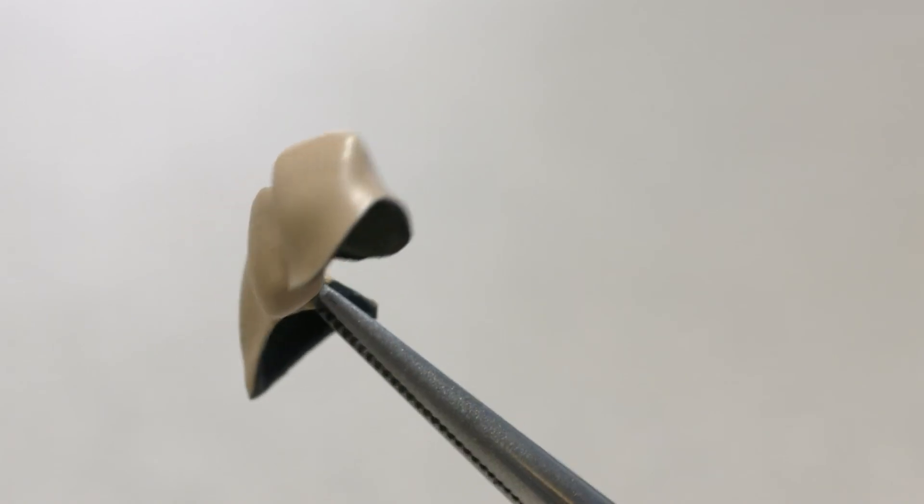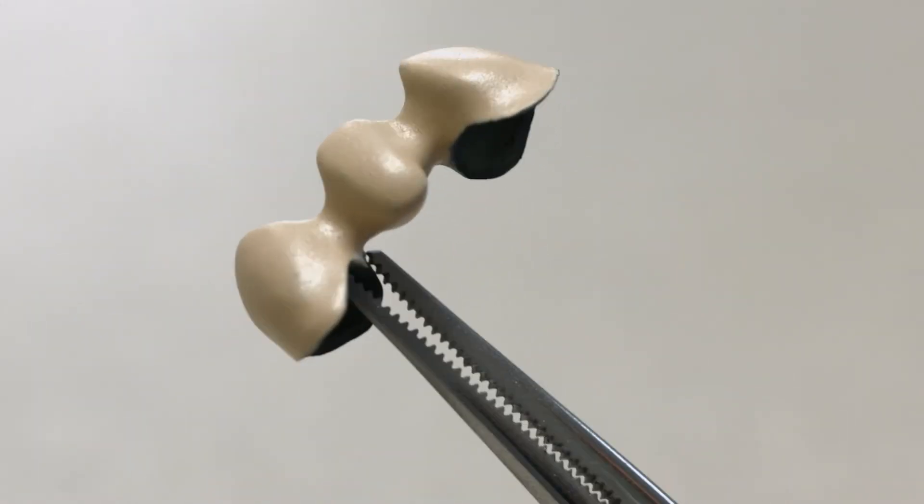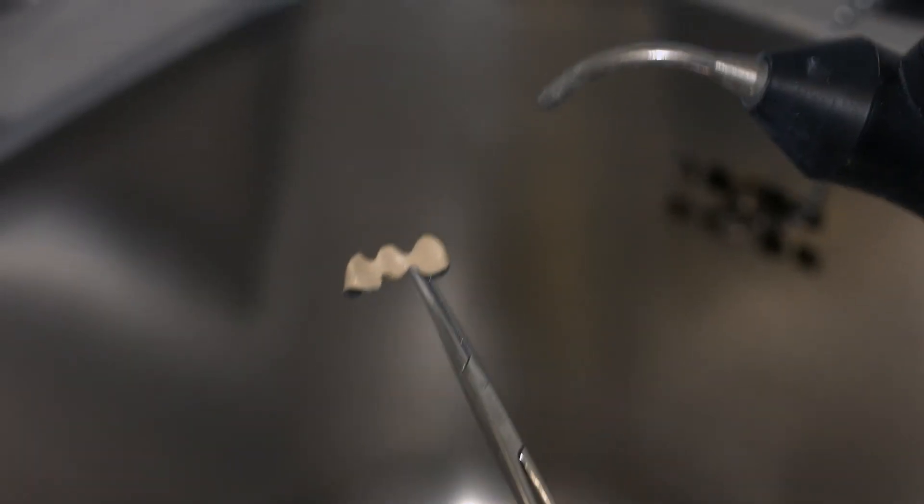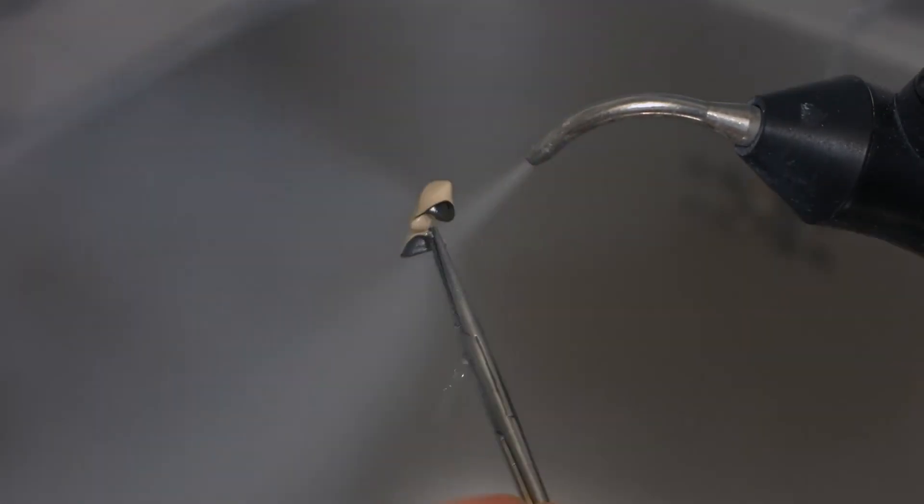The veneering surfaces of the alloy framework must be entirely covered with opaquer. Thoroughly clean the metal framework using the steam jet before you start to apply the ceramic material.